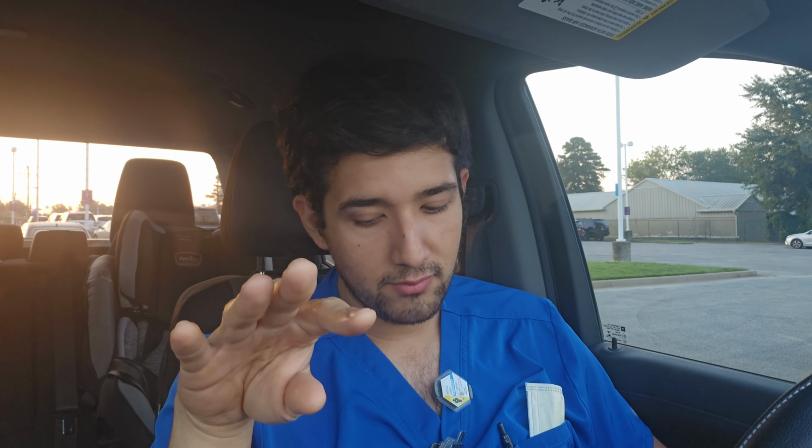From time to time on our portable machine, you can copy exams and do what I call drag and drop from one file to another. Sometimes in trauma rooms you need to do this, like if you're doing a femur and a hip. If you already shot the upper hip, you kind of have the upper femur in a way, so there's no point in reshooting the patient. You can copy, duplicate the exams. Sometimes when you're moving it in between the patient's files on the portable, it will freeze and you'll have to restart the little portable machine. So you gotta be careful of that.